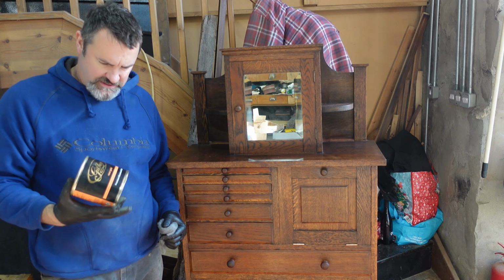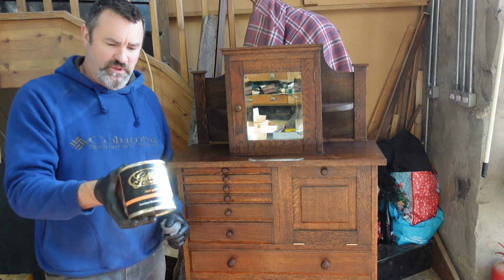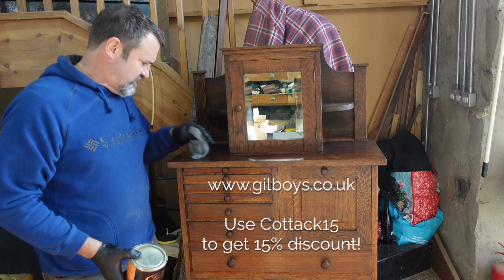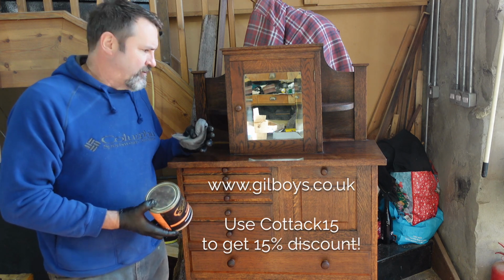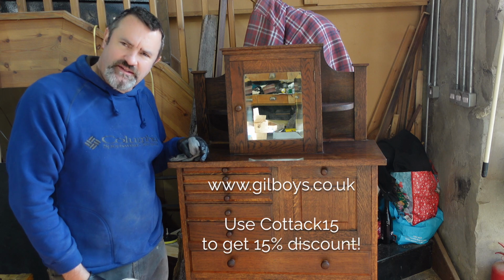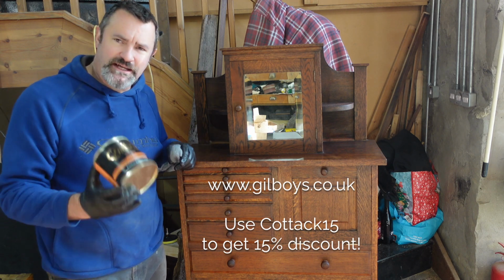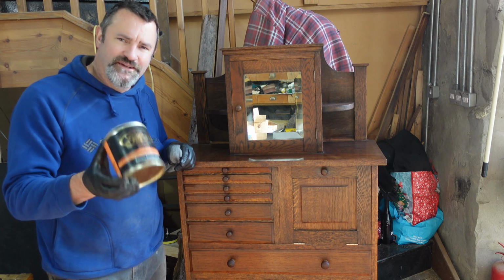Okay, we're getting close to the end. I'm going to go for some Gilboy's rose gold because I'm trying to get the sort of slightly redder rosewood type colour rather than too dark an oak. But it's coming along really nicely and I think this is going to make it look fantastic.